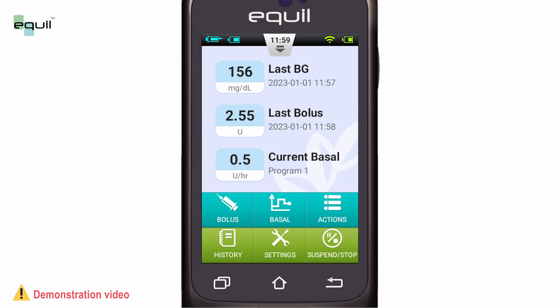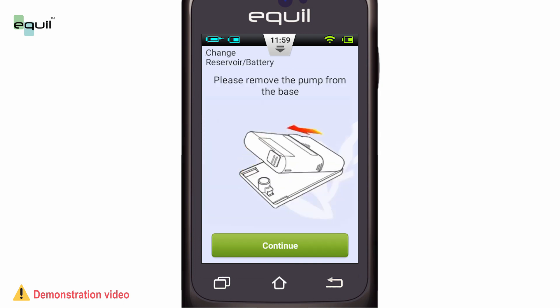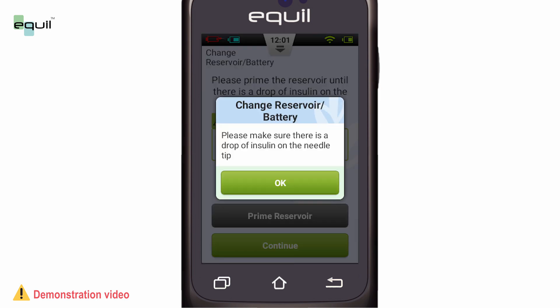In the event that the insulin reservoir runs out of insulin, we should replace it with another. Also, the same procedure will apply when changing the battery. In the home screen, select Action Change Reservoir Battery and an animation will pop up asking you to remove the pump from its base. Now, remove the pump from pump base and select Continue. Changing Battery Reservoir confirmation message will pop up. Select Yes.